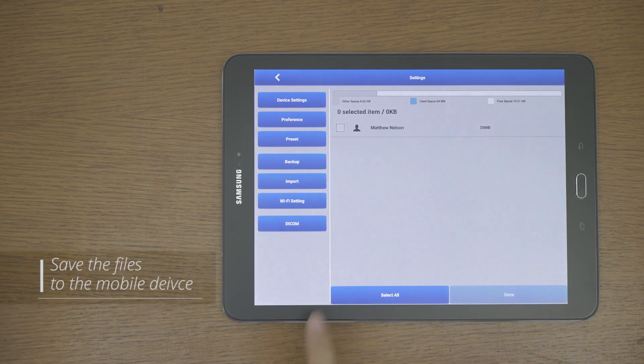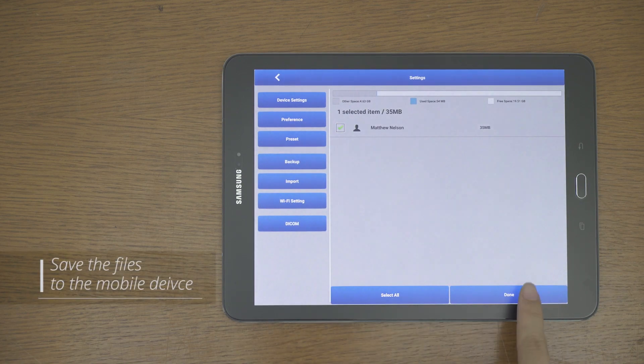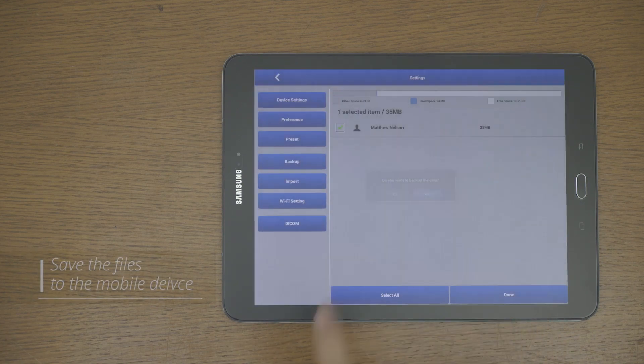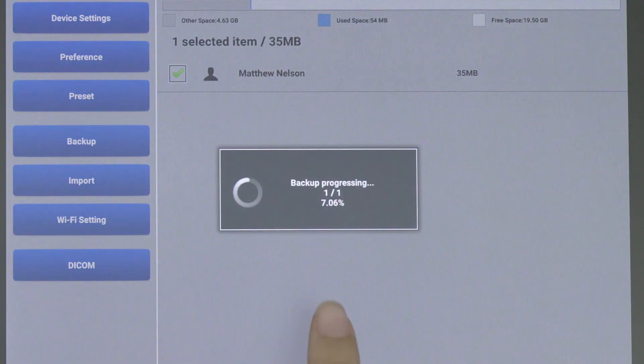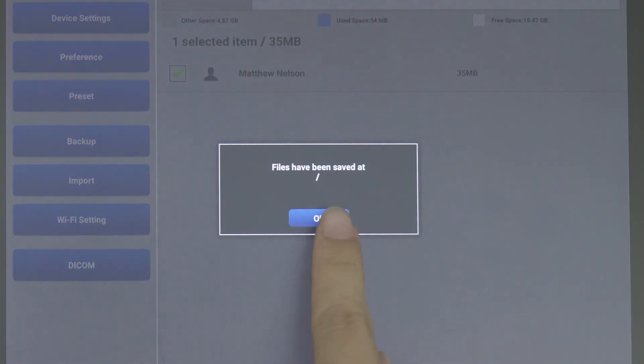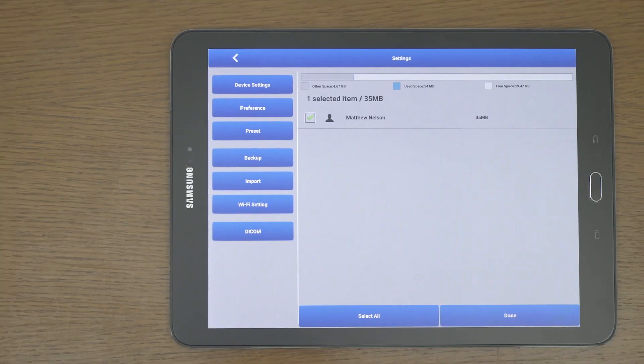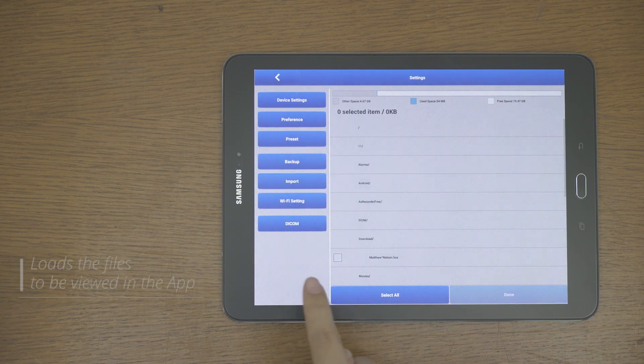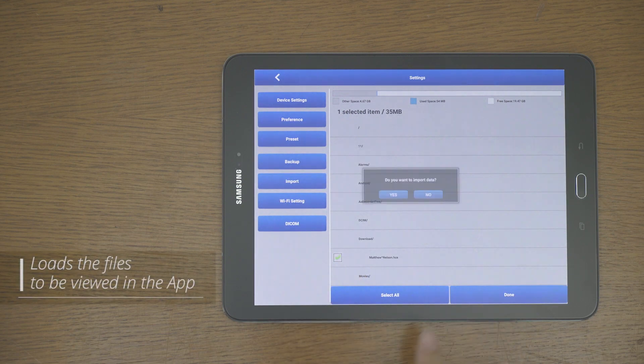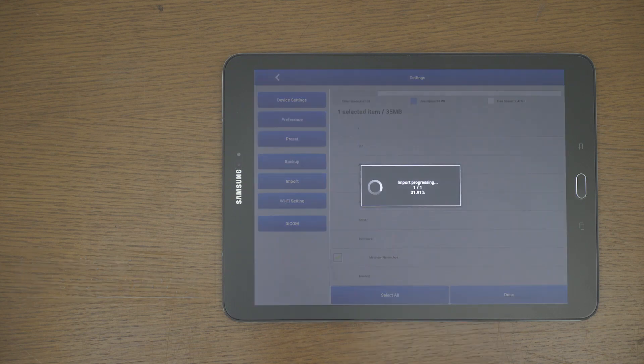Backup is the function that saves the files stored in the Sonon app to the mobile device storage. Import is a function that loads the files stored on the tablet into the Sonon app to be viewed in the app.